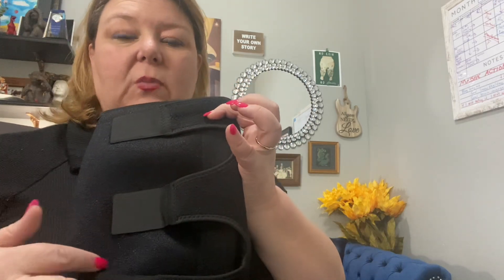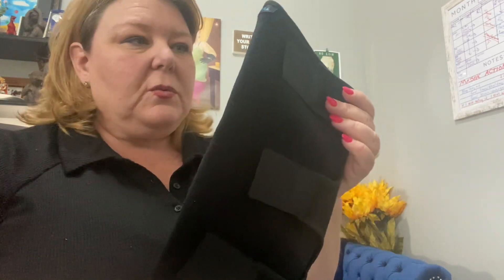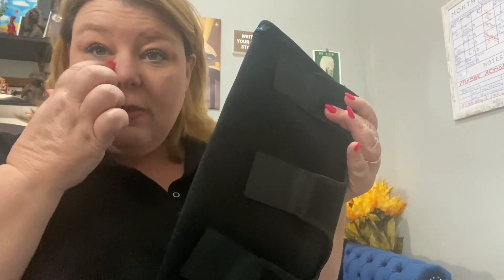I commented about the design having too many openings for people who have swelling, because I felt like the swelling could escape. They actually redesigned their product based on that feedback, which is really cool. So this is how it came — they updated it and sent me one for free to try out.